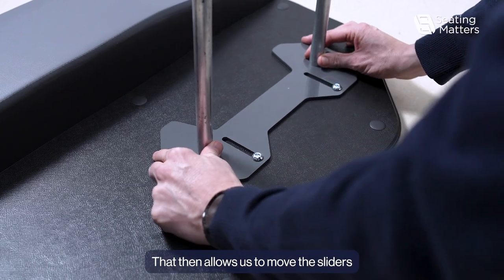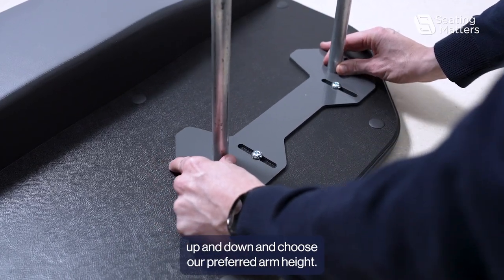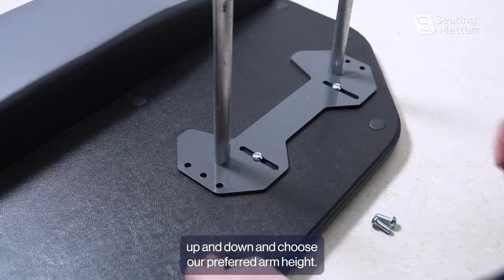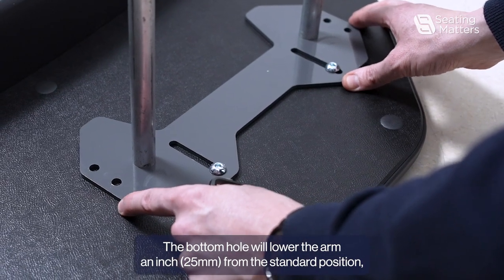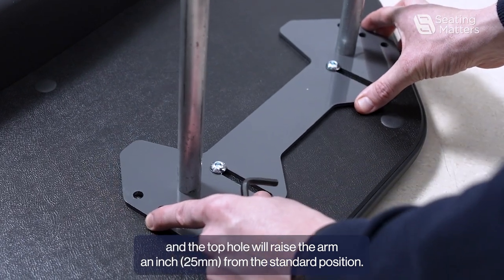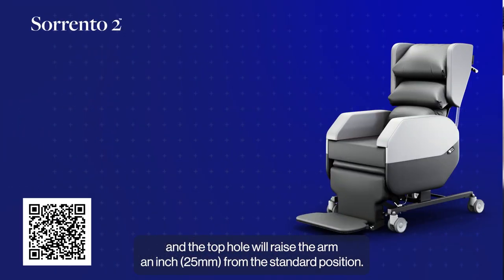That then allows us to move the sliders up and down and choose our preferred arm height. The bottom hole will lower the arm an inch from its standard position, and the top hole will raise the arm an inch from its standard position.